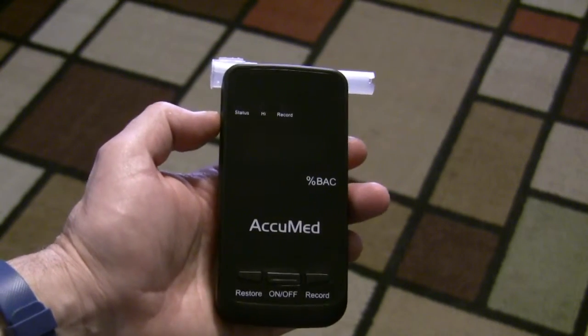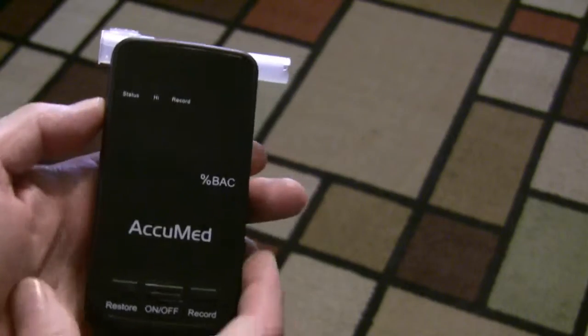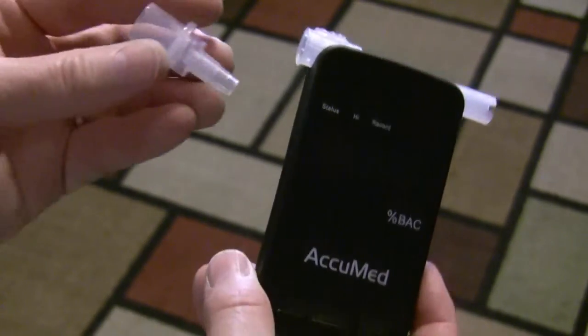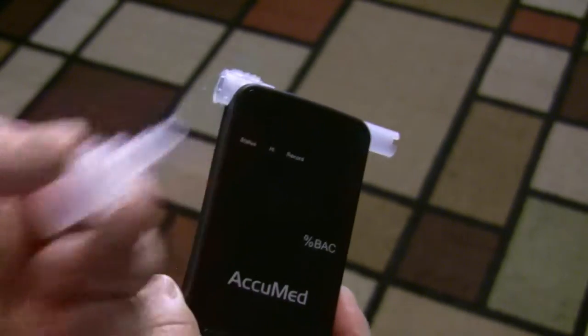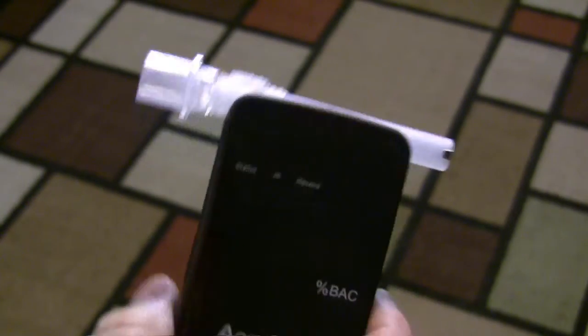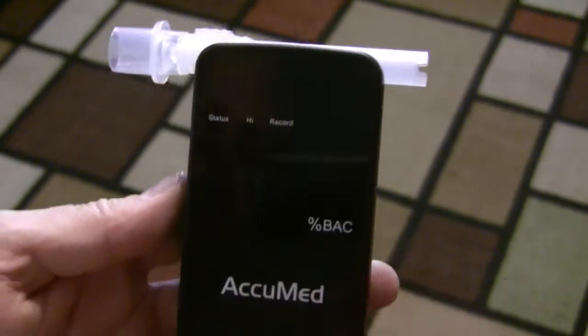It comes with an instruction manual. It comes with the unit itself. I do not believe it had batteries — I think I had to get batteries. And it comes with two mouthpieces. So what I'm going to do is I have not had anything to drink today, so I'm going to test this and see how it shows up.